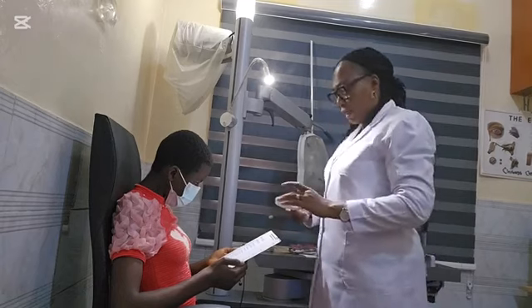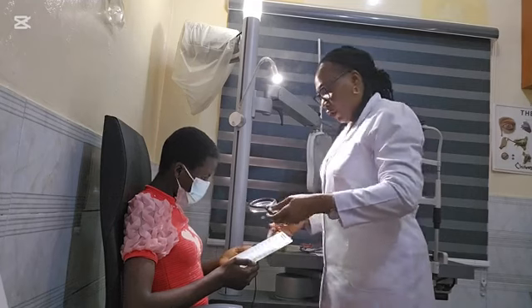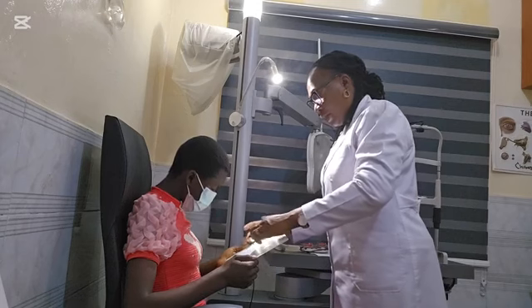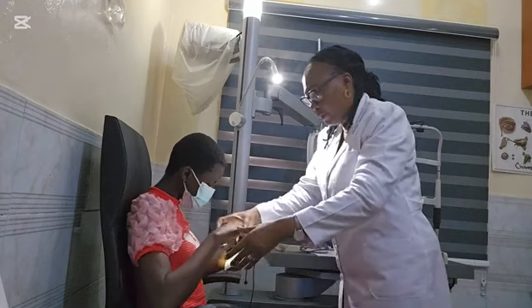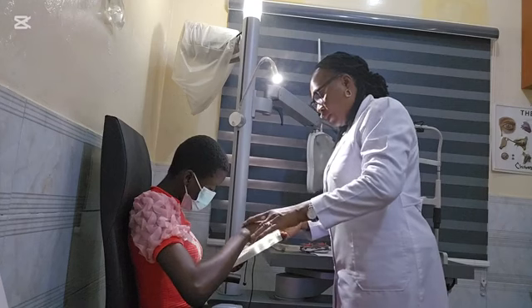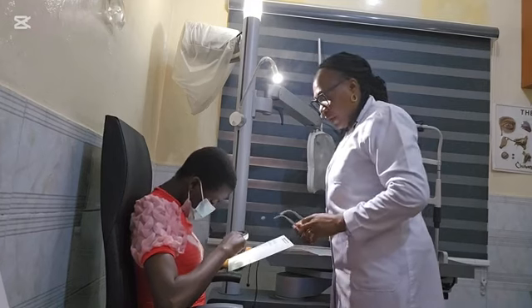Okay, what I have here now is a handheld magnifier, 3x, illuminated as well. Okay, baby girl, place it on it and you raise it out to see when it's enlarged and easier for you to read. Is that okay? Good. So you hold it, place it on the material. Good. You raise it out. Good. Is it clear? Yes. Can you read? Yes. Oh, beautiful. So go ahead and read. Let's see. Yes. Good. You've seen how she read with a handheld magnifier.